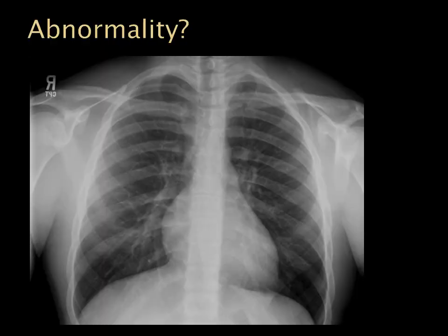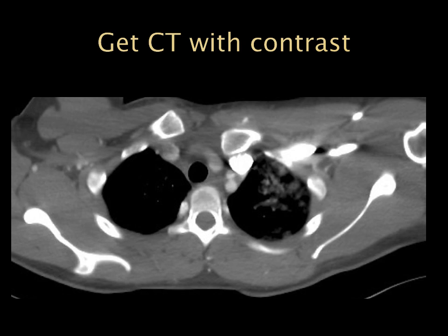On this chest x-ray, the abnormality is a difference in the level of the clavicles — they are uneven, and this is sternoclavicular joint dislocation. We can get a better analysis with a CT with contrast, which I prefer so we can evaluate the great vessels and make sure there's no compression of those vessels — which would be helpful for our orthopedic colleagues if they're going to operate.